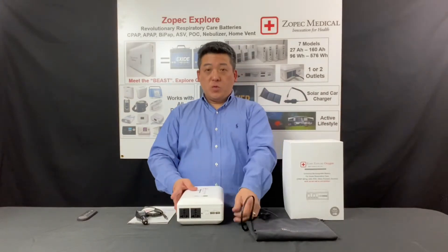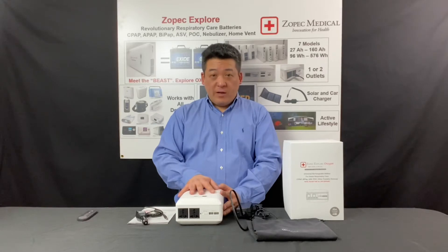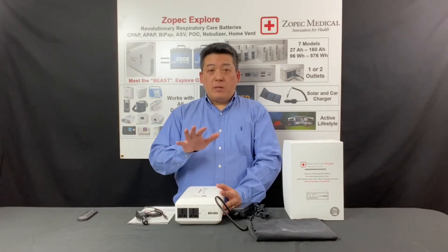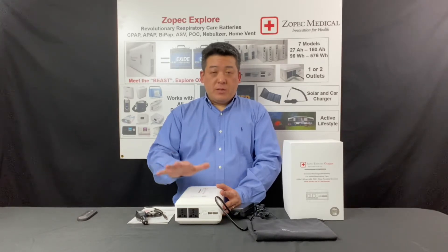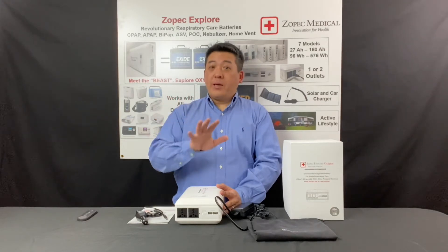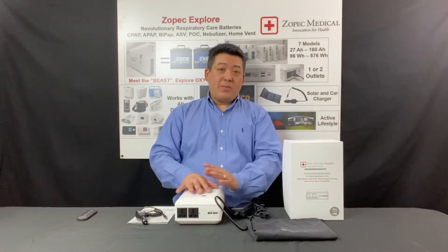The first thing you do when you receive your battery is to charge it. We recommend you charge it overnight. Depending on the capacity level, the Zopac Explore Oxygen can take up to about 12 hours to charge. Please note that charging initially is not linear. The battery is calibrating itself, so it might be stuck at a number for a while — like hours — and that's normal. So it's easiest to just charge overnight and not look at the capacity counter.